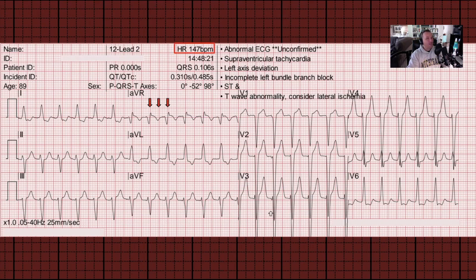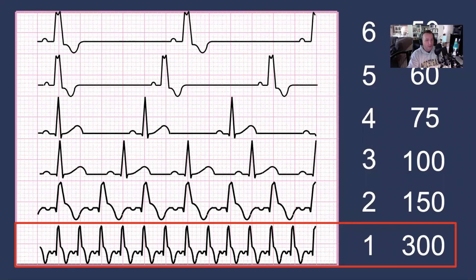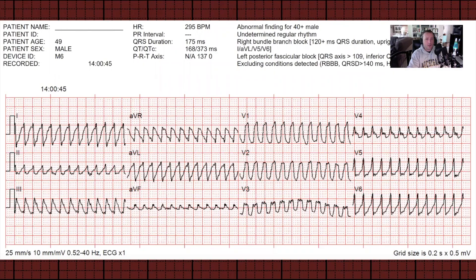What about heart rates even faster? It's rare, but occasionally we see heart rates very close to 300, especially in patients with Wolff-Parkinson-White syndrome who go into one-to-one atrial flutter. In this particular case, we should have only one large block in between cardiac cycles. Using this one in lead I — boom — we can see that we have one large block in between R waves.